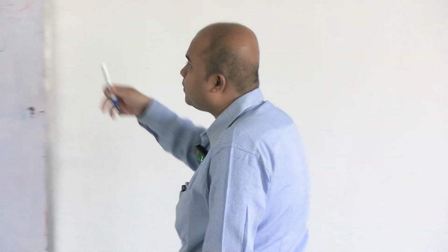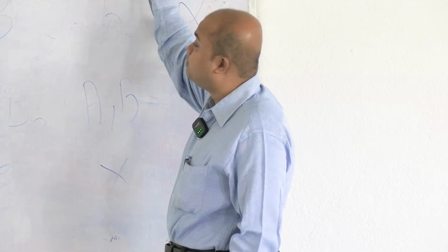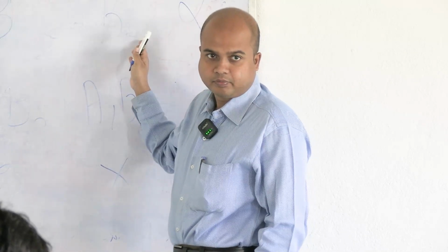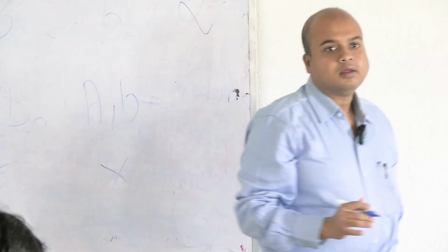So if an A positive individual is transfused with B positive blood, then the recipient is A positive. So the recipient's beta will attack the donor's capital B agglutinogen. Reaction will occur between beta and B. Reaction should also occur between alpha and A, but it usually does not occur in the case of the A positive person being the recipient, because the donor's plasma is highly diluted in the recipient's plasma. But the donor's agglutinogen and the recipient's agglutinin will cause the major transfusion reaction.